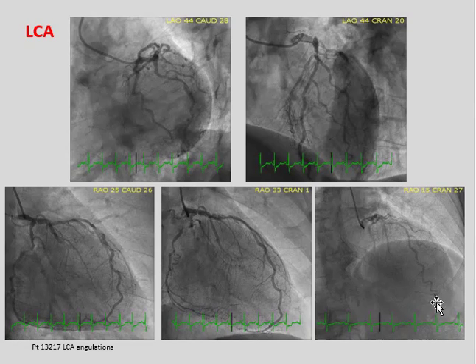In this case, that is the LAD. It's a different angle. They're all different angles. And the LAD, if you saw it in a bigger image and a moving image, you might see the septal perforators coming off it and the diagonals going off to the right. And this is missing a circumflex, either because the injection is poor, or it's occluded, or it's anatomically aberrant.